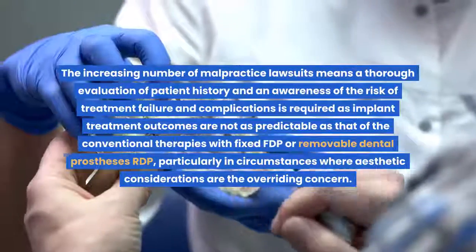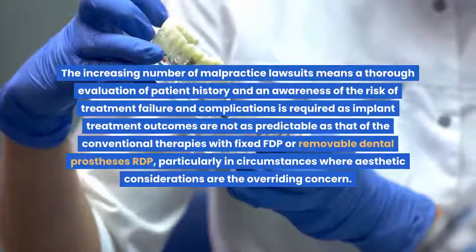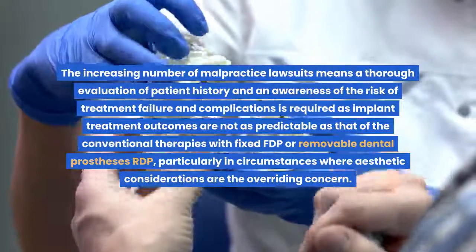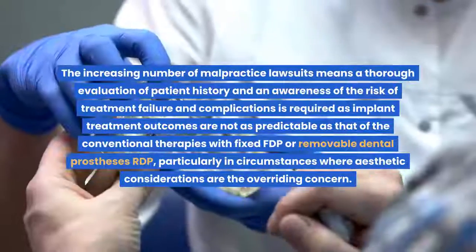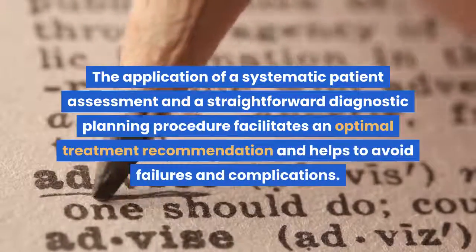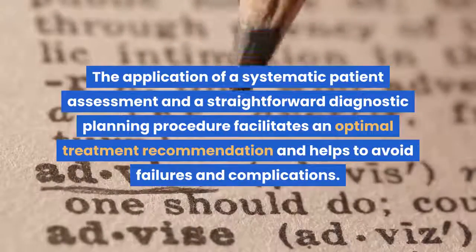risk of treatment failure and complications is required, as implant treatment outcomes are not as predictable as that of the conventional therapies with fixed FDP or removable dental prostheses RDP, particularly in circumstances where aesthetic considerations are the overriding concern. The application of a systematic patient assessment and a straightforward diagnostic planning procedure facilitates an optimal treatment recommendation and helps to avoid failures and complications.